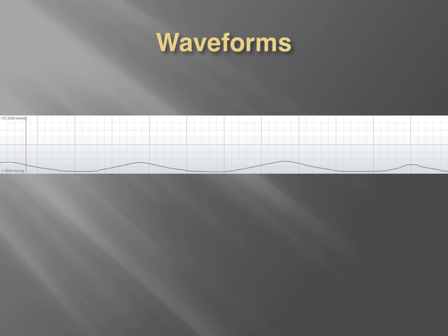Now you can recall from what we were just discussing, a normal waveform should look like this. And you can see here, if we march out this reading, this patient probably has about 18 respirations per minute, give or take a little bit, but by far not hypoventilating as far as respiratory rate. So the respiratory rate is actually normal.